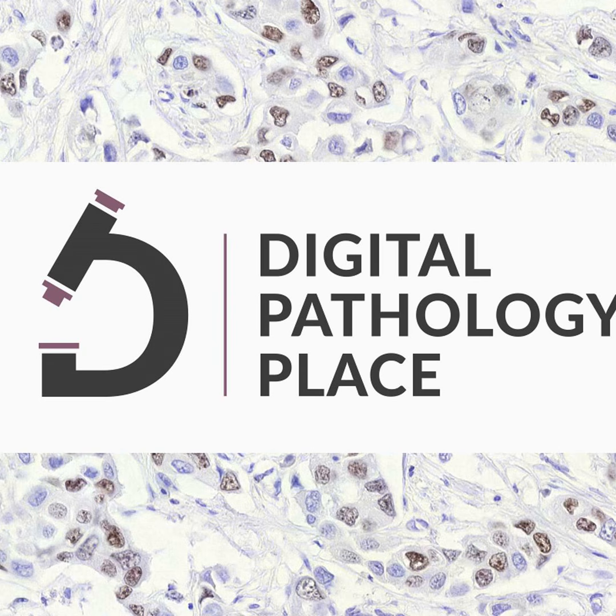But despite these challenges, few institutions have a complete digital cytology workflow, and technical investment have replaced conventional rapid on-site evaluation by different telecytology systems. So we're still doing live microscopy, but now it's telecytology. Some can be scanned, but most are being done with remote controlled microscope.